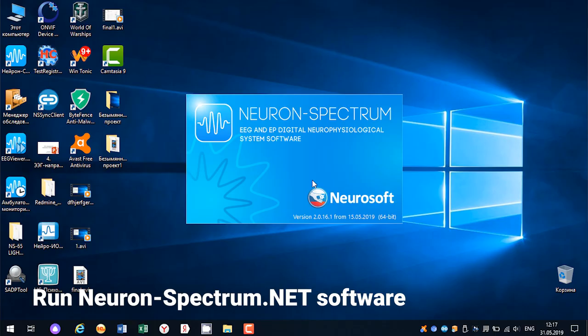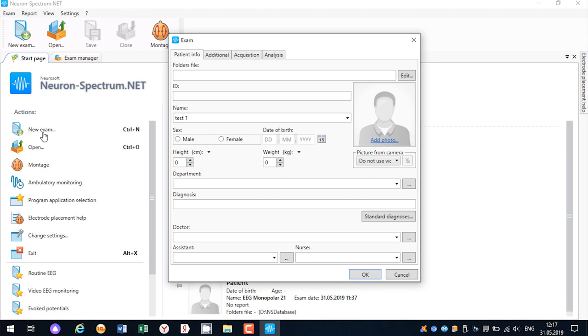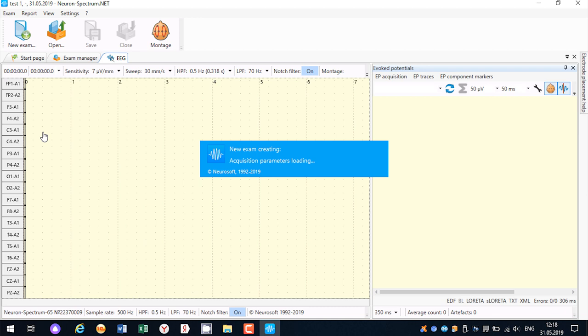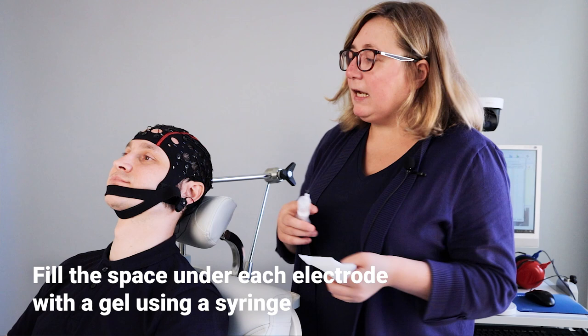Run Neuron Spectrum Net software and check impedance. Using electrode gel in the syringe, I fill the space between the patient's head, skin, and electrodes.